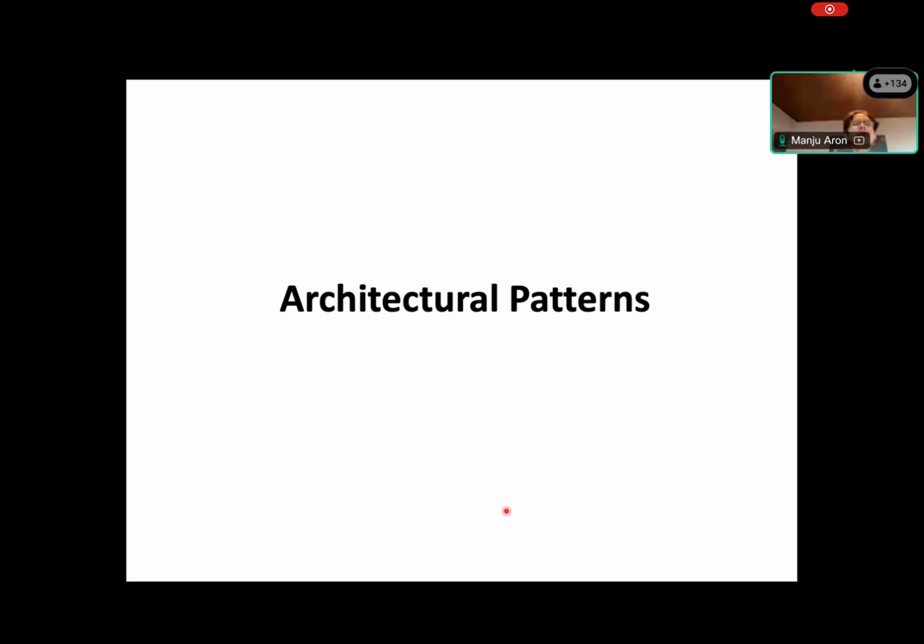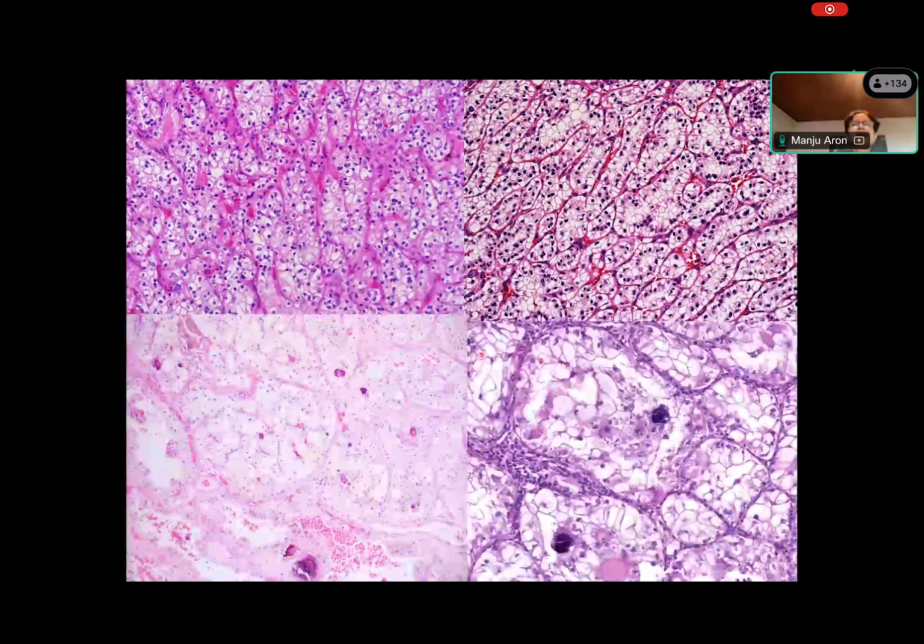Now let's look quickly at some architectural patterns. So here, these are all tumors with a nested kind of pattern.